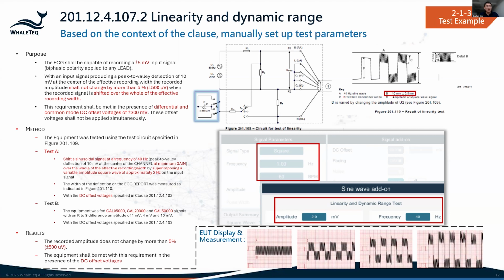So if you are familiar with the standard and interpret it properly, you can just operate a GUI and check the ECG trace on your backend or display. Well, since we go this far, why don't we just streamline it?